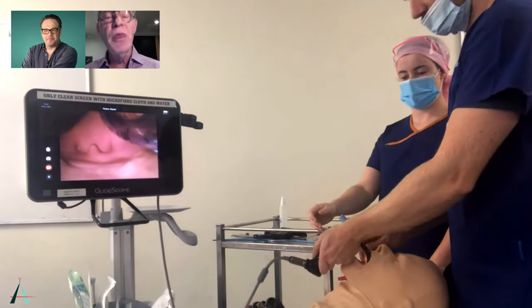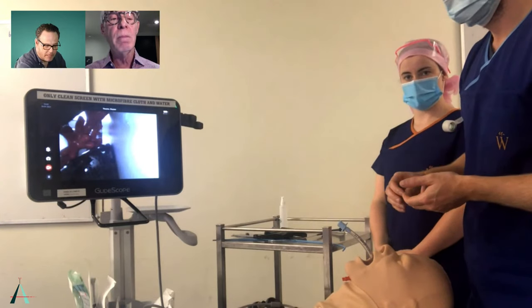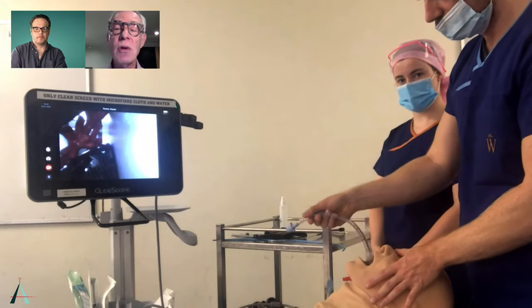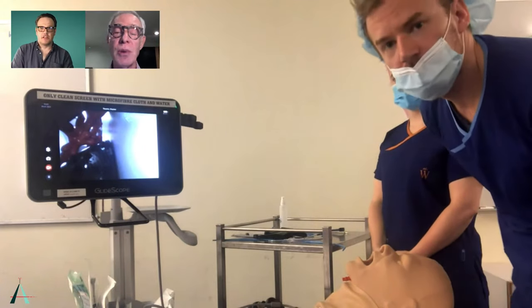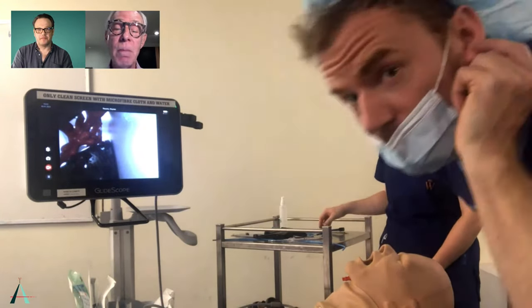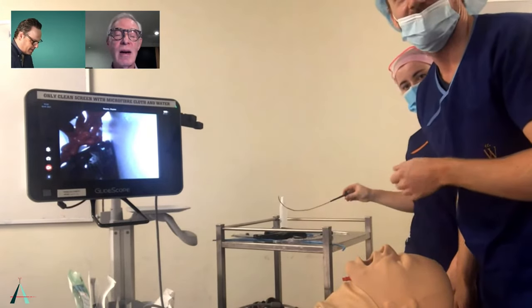One of the troubleshooting things that we can cover very quickly is the patient with a small mouth, in whom there's difficulty fitting the laryngoscope and the endotracheal tube in and not feeling very crowded. So can I ask you to demonstrate this technique, Matt? Yeah, sure. And I'll talk you through it. If you can put the stylet back in the endotracheal tube. Matt, put the stylet back in the tube. Maybe I'll do it, Richard. I think they're struggling with sound. Sure. Yeah. All right. Okay.